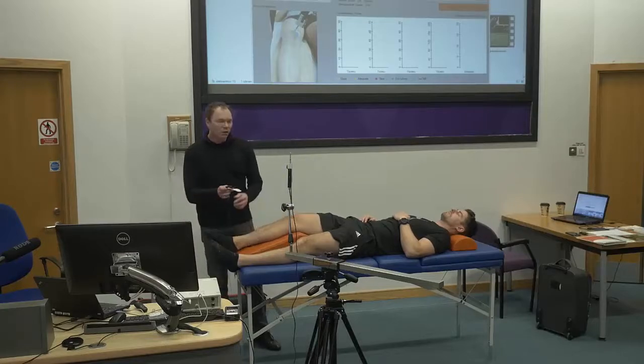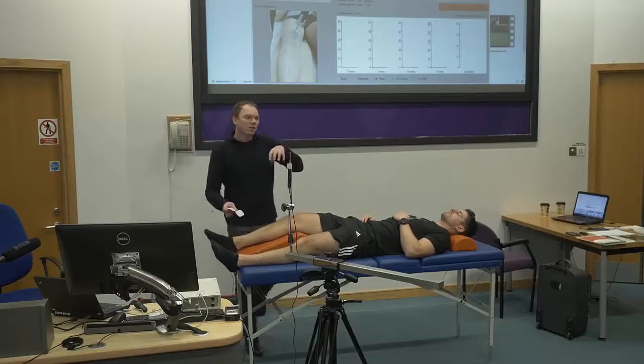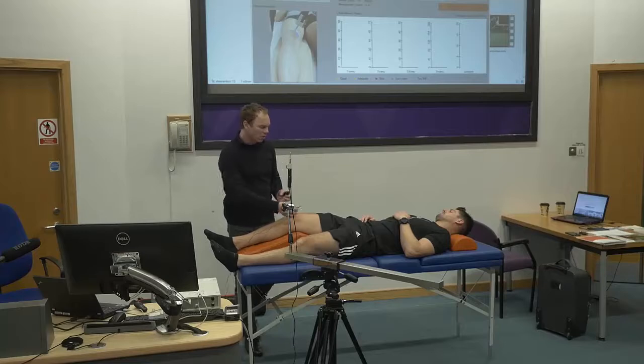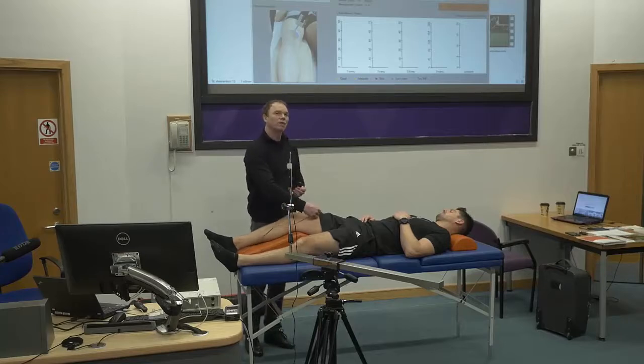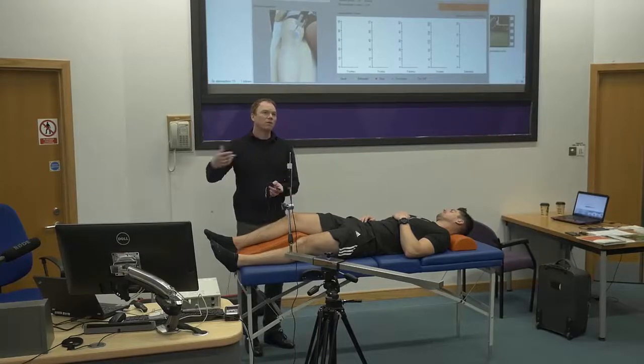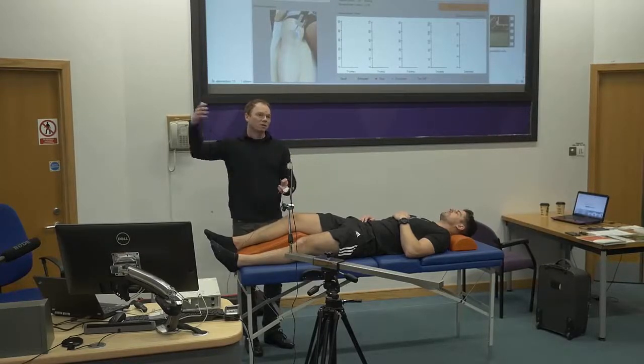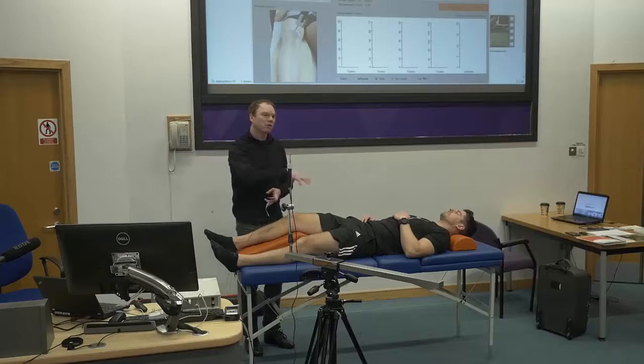Relax. If I want to isolate as much as I can, I would like to put both electrodes within that muscle belly. If I go across — if I go too high with one electrode — I will get direct co-contraction from the rectus femoris muscle, which will affect the result. The criteria should be to try to isolate as much as you can.